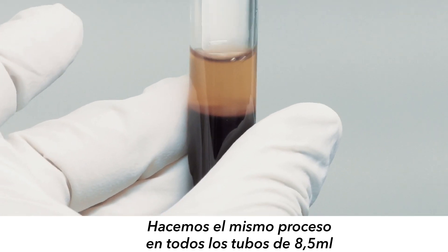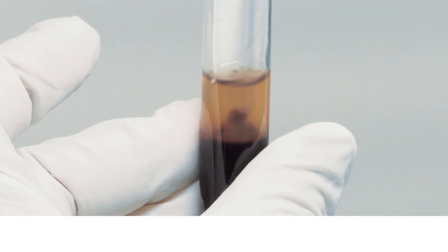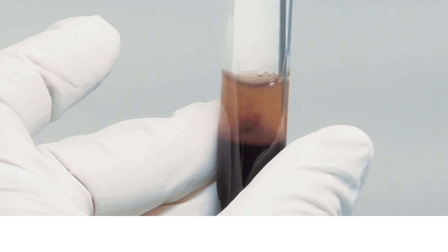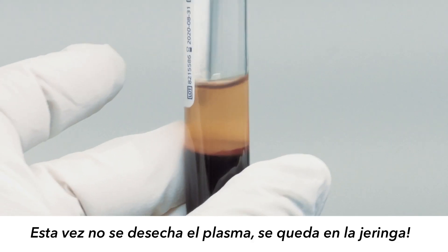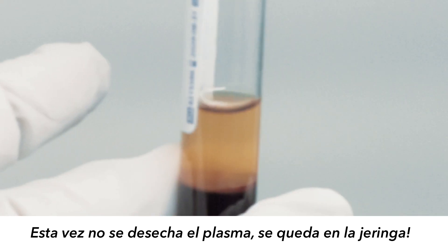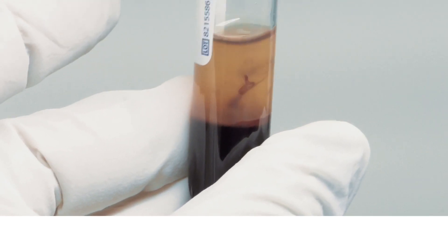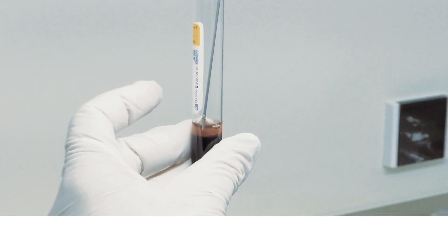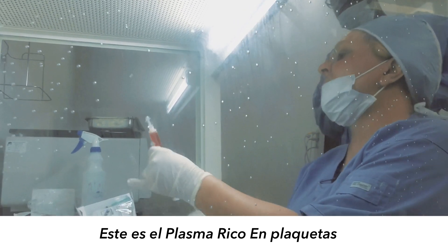I'm going to do it again. This time you don't discard — you just keep it. This is the platelet rich plasma.